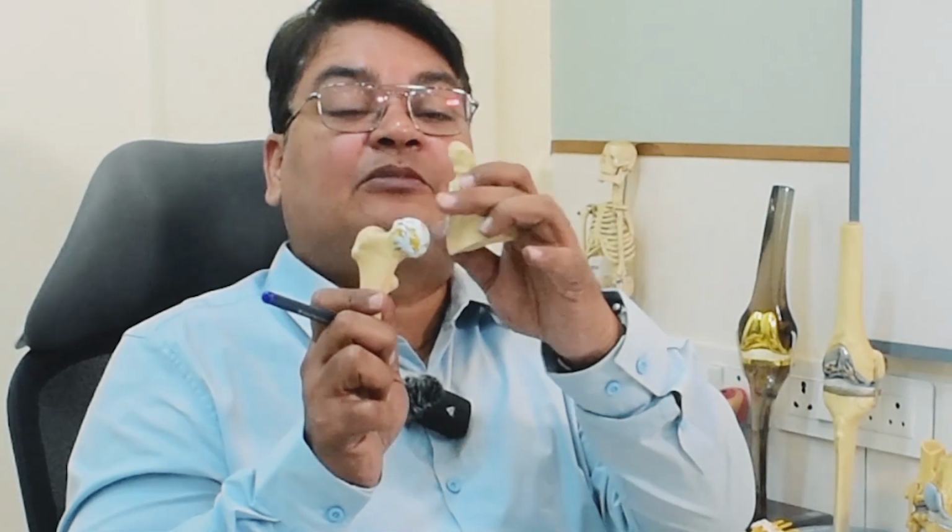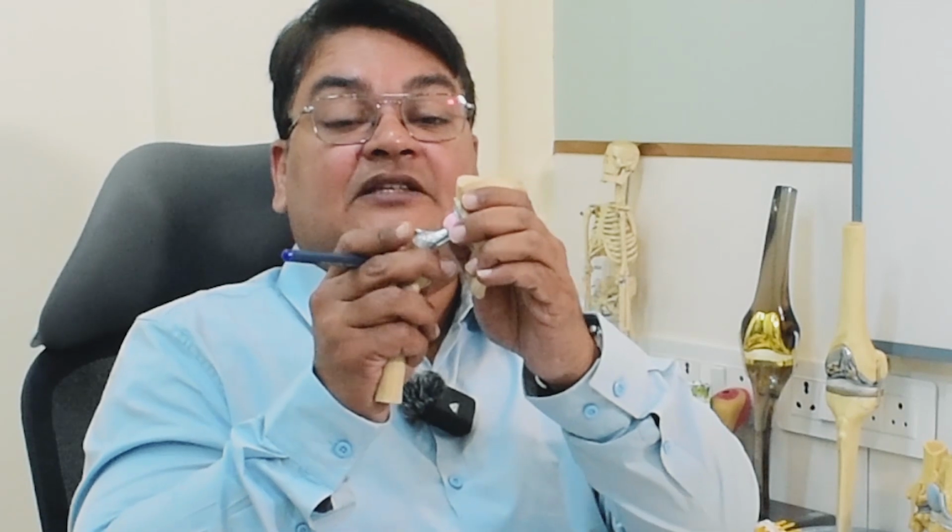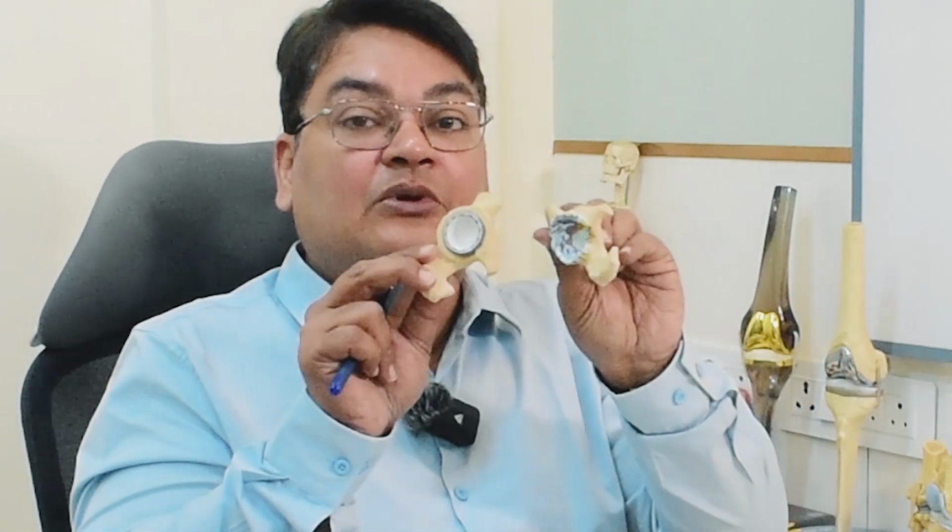So in hip replacement, what we basically do is replace the ball and the cup. This is the diseased ball, this is the cup. We replace the ball and cup with a new joint. This is the ball and the cup, and it is replaced like this. The ball which was diseased is replaced by a new ball. The cup which was diseased is replaced by a new cup.